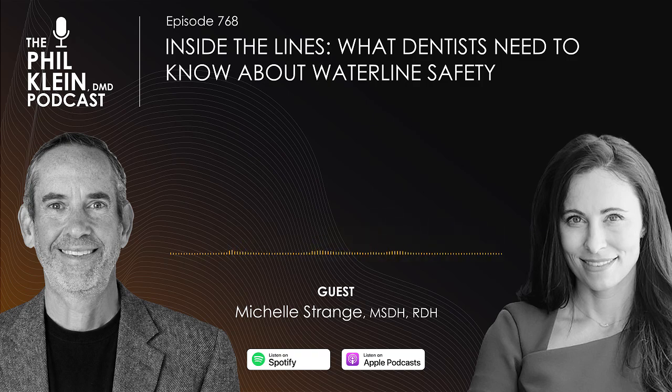So for us, it would either be a tablet being placed, an appropriate size tablet, because remember we all have large and small water bottles, so making sure that you have enough tablet that will go into the water bottle, and also making sure that it's for distilled water or for tap water, because sometimes there will be some nuances to that. That's one way of treating on a daily basis. There's also, like we've been saying, the cartridge or straw system. So the little tube that will stay on the line for however many days, like Stericyl's 365. There's some that are for 6 months.